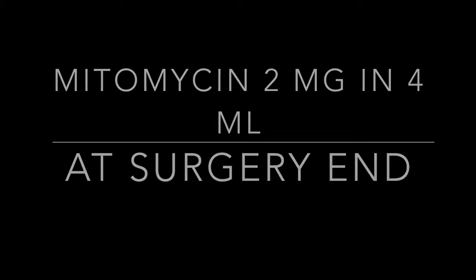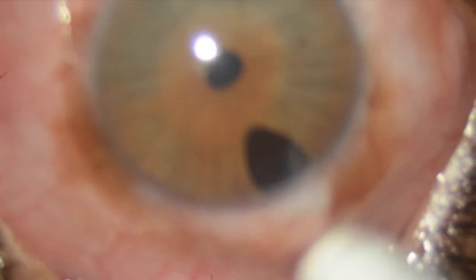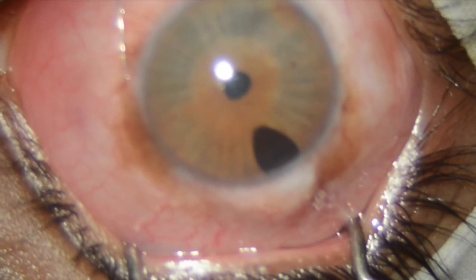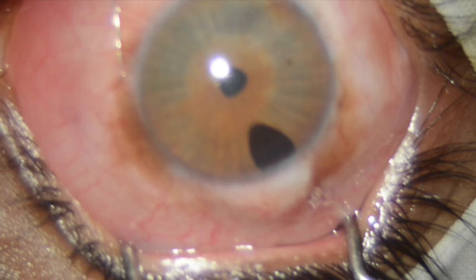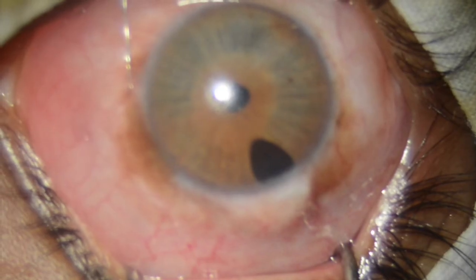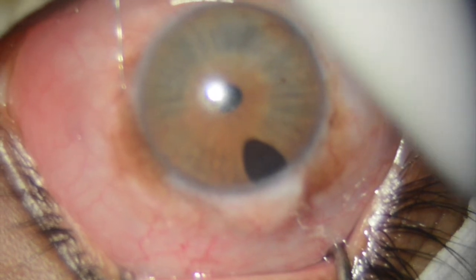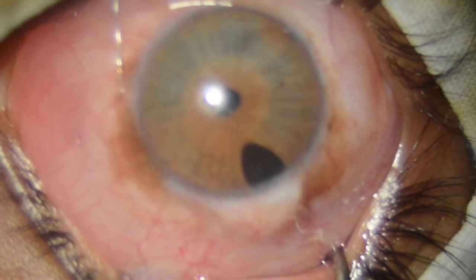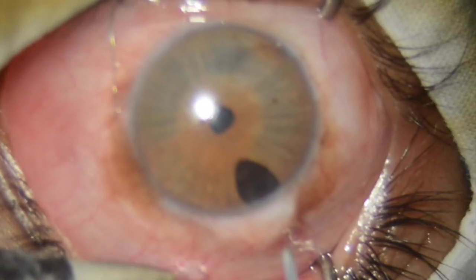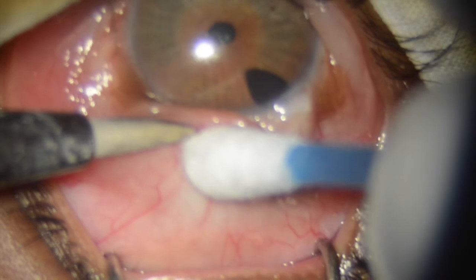We have done this many times and it does not affect the health of the bleb or the conjunctiva. This is the eye — you can see thick scar in the area of the peripheral iridectomy. So should we go after the scar or bypass it and operate at a more comfortable place? My choice is to not take the scar and make new tracks.